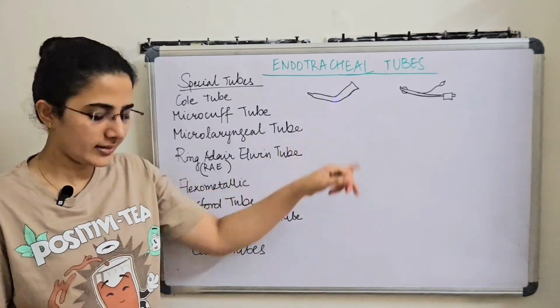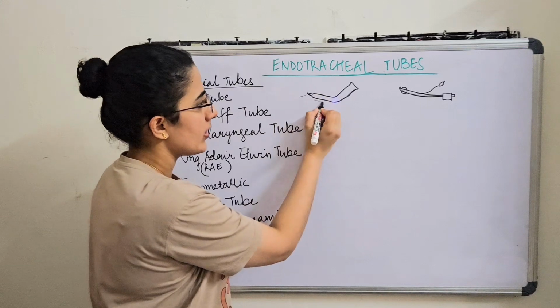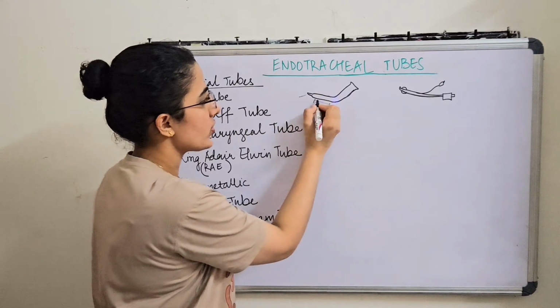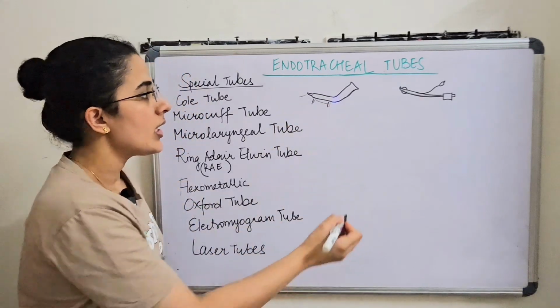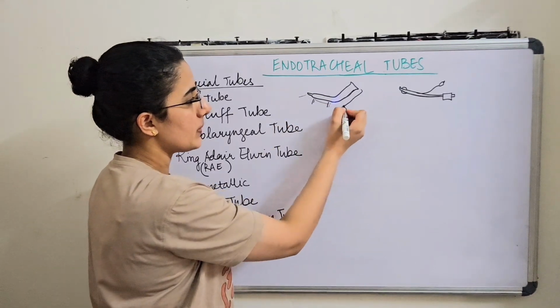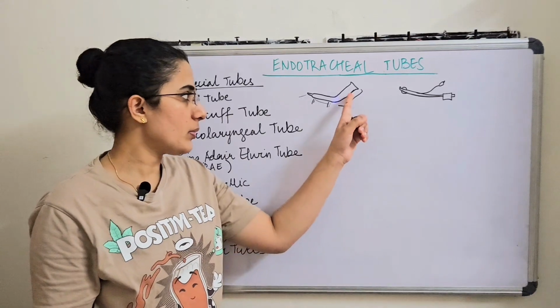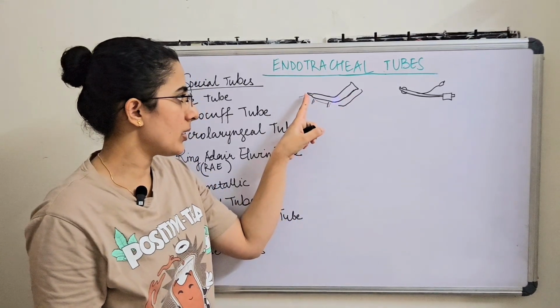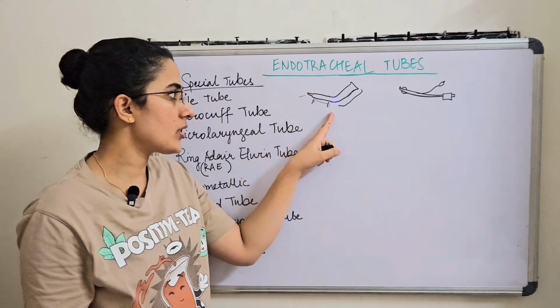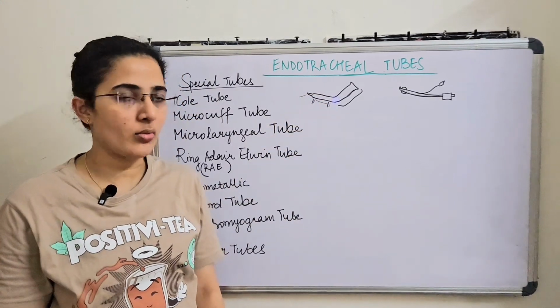It looks somewhat like this. It consists of a narrow end, which is the portion that will be the internal diameter of this tube. The proximal portion is quite thicker. There is a shoulder, and the patient end will be uniform, which will be the internal diameter of this tube.